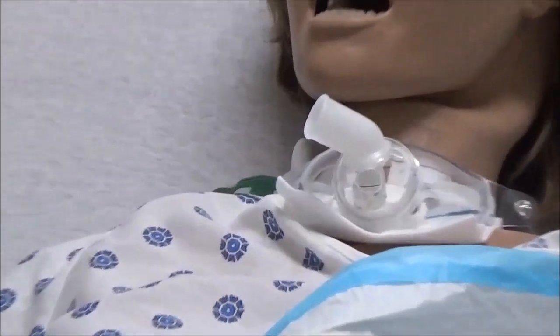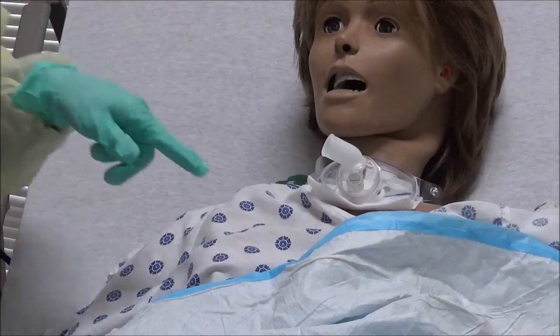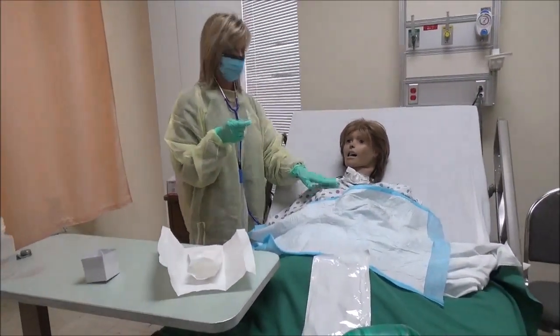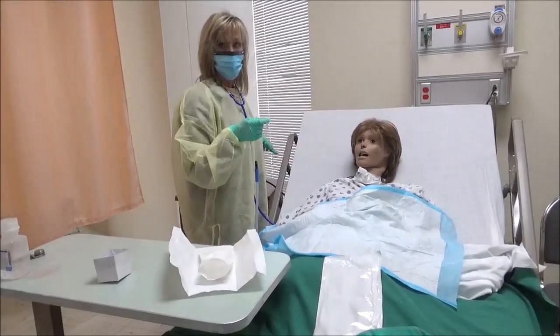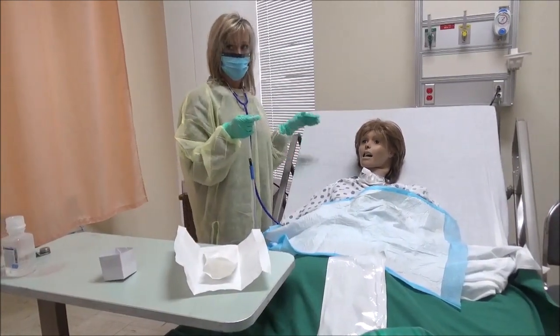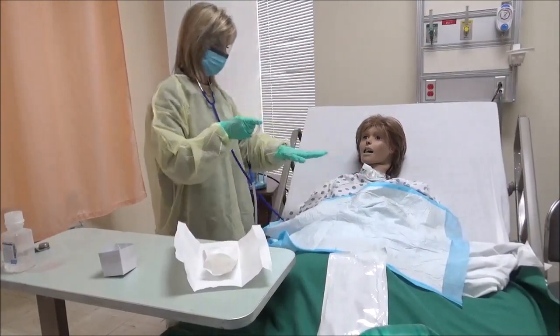And you know what? I should have probably turned off my suction while I was auscultating my client's lungs because I could probably hear them better. So if it doesn't interfere with your ability to hear the client's lung sounds, feel free to leave your suction going, but just keep in mind that you may want to turn that off so you can hear your client's lung sounds really well. So now my client's lung sounds are clear.